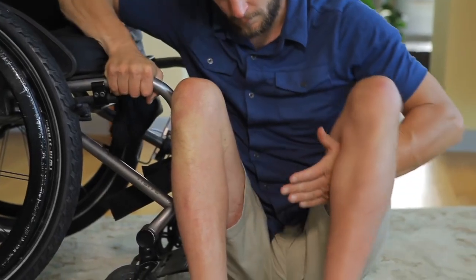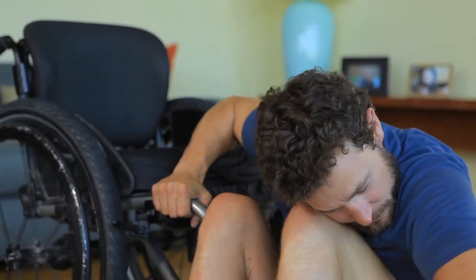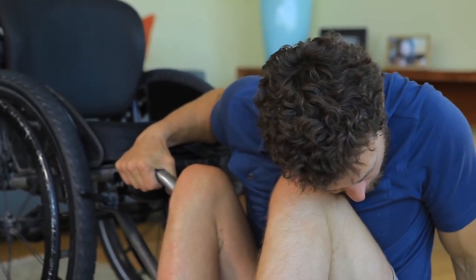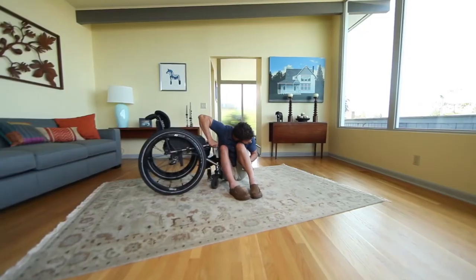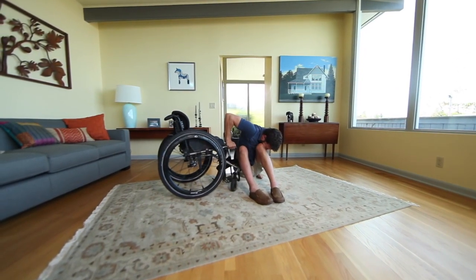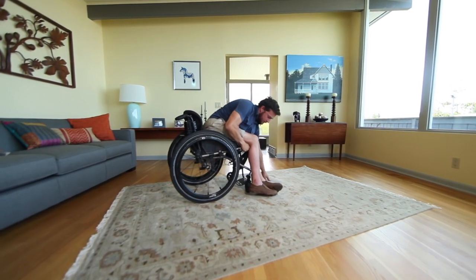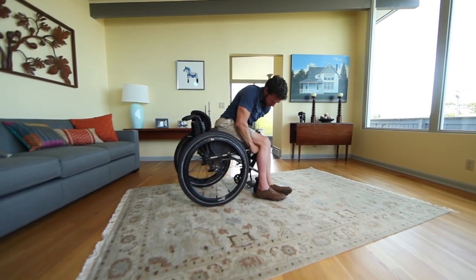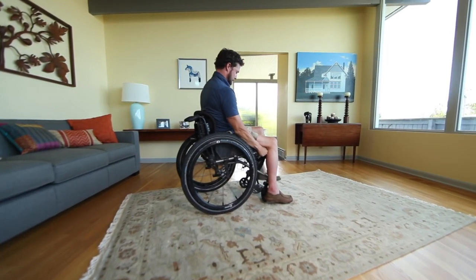Tuck your feet close to your body, leaning your legs against the front of your wheelchair and pinning your knees with your chin. Position your trailing hand in a fist down by your hip on the floor. To swing your hips up to the wheelchair, lean forward and down toward your fist. Keep your shoulders down and vault diagonally up to the front of your wheelchair. Finish by repositioning your hips and feet on your chair.